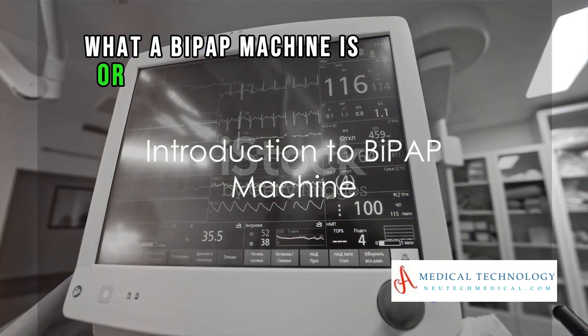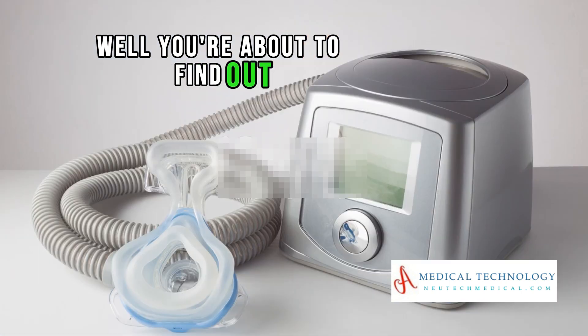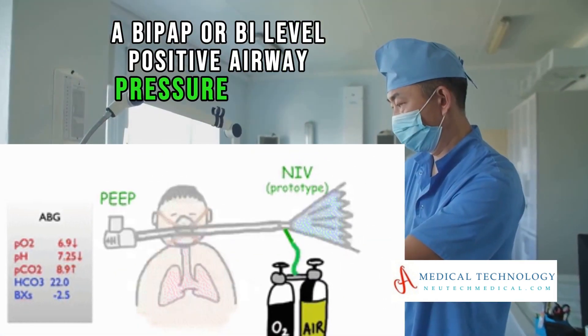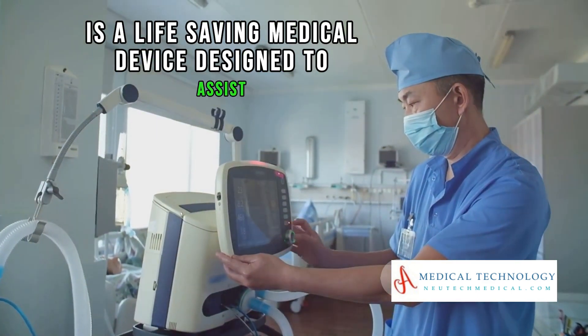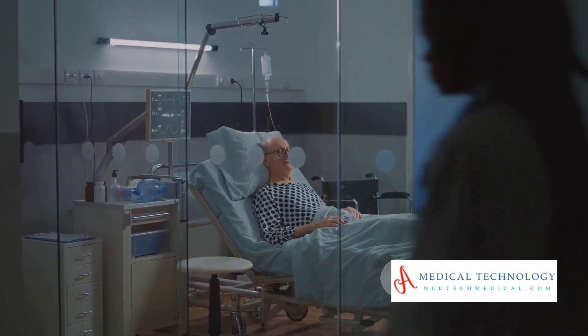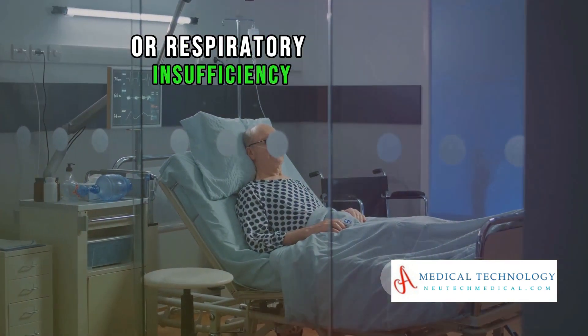What a BiPAP machine is or why it's so crucial? Well, you're about to find out. A BiPAP, or Bi-Level Positive Airway Pressure Machine, is a life-saving medical device designed to assist individuals with breathing difficulties. It's particularly beneficial for those battling sleep apnea or respiratory insufficiency.